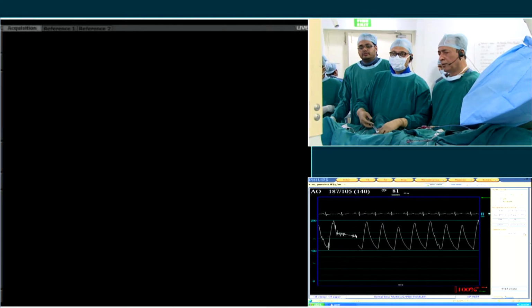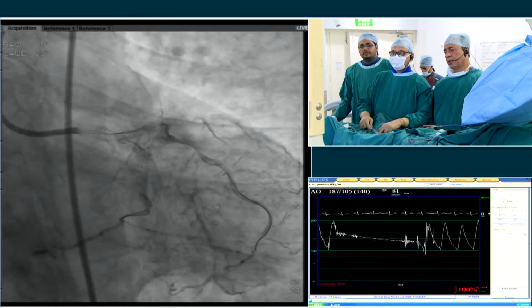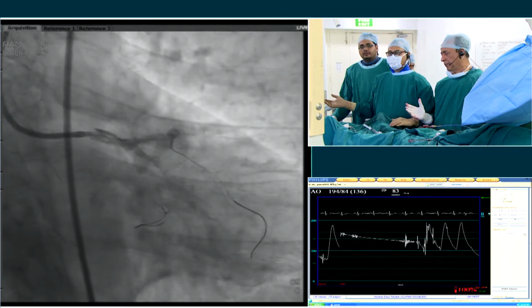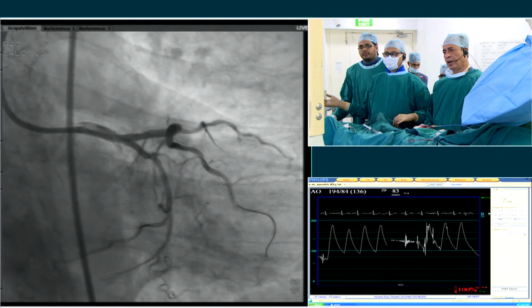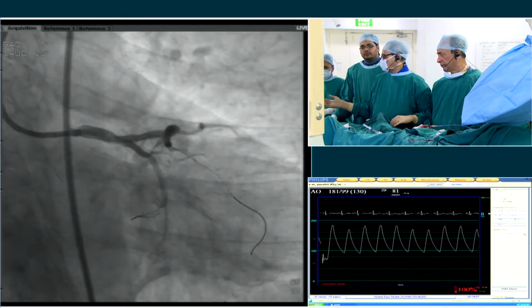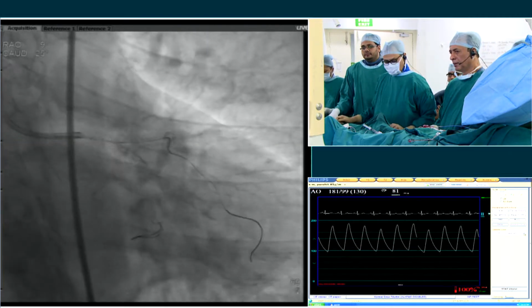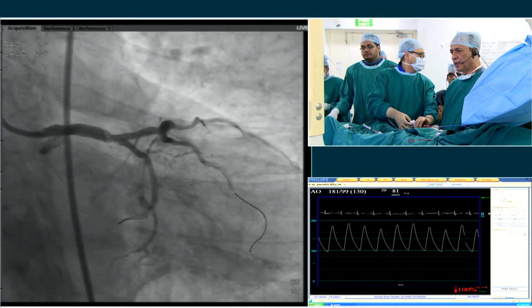No, they want to show us the end. No, we'll come back to you. It's okay. Okay, give us the balloon, 2.5 and 3.5. I told them to keep the balloon, idiots. Hello? I think they are off.